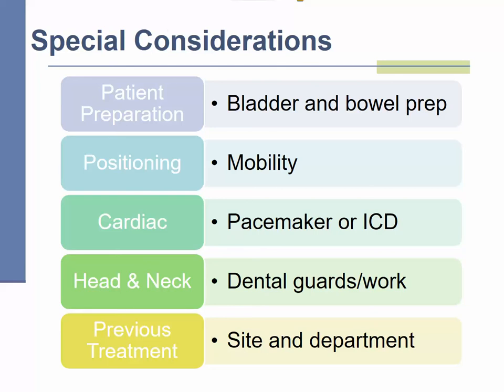In addition, some of our patients have a lot of metal fillings, and we need to use what's called a dental guard to help reduce side effects as well. And these dental guards are typically manufactured by the patient's dentist, and this needs to occur prior to the CT simulation appointment, as the patients do need to wear these guards underneath their mask for their CT scan.